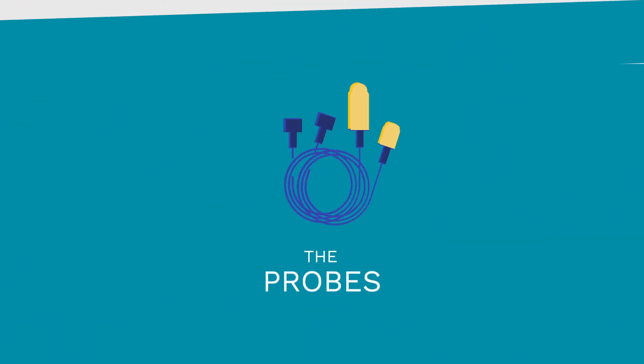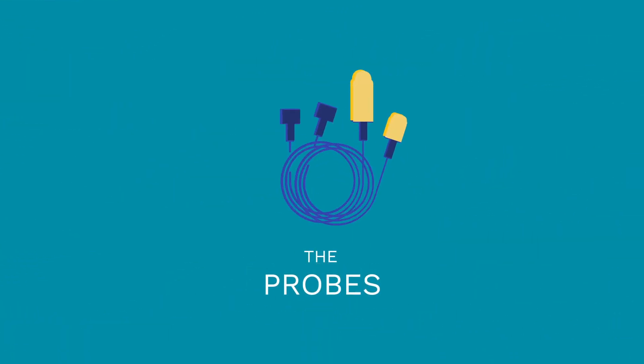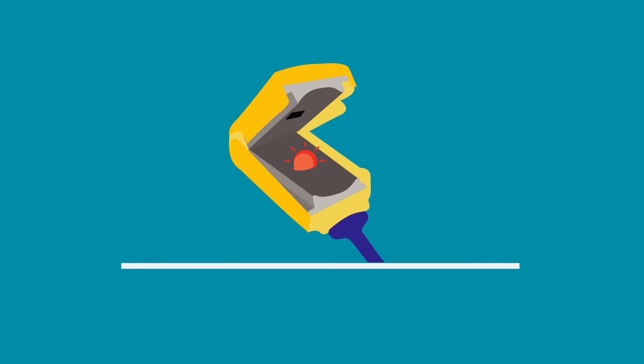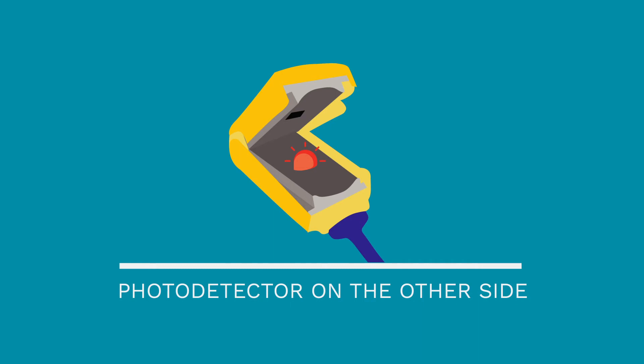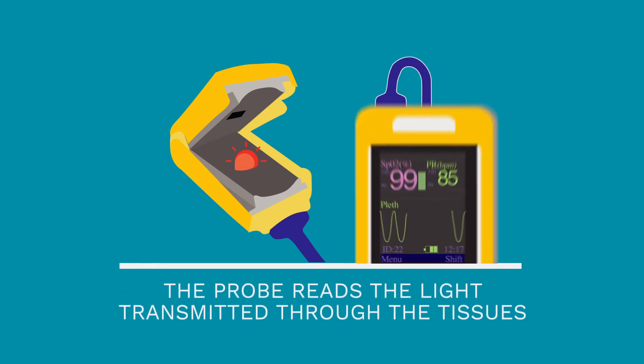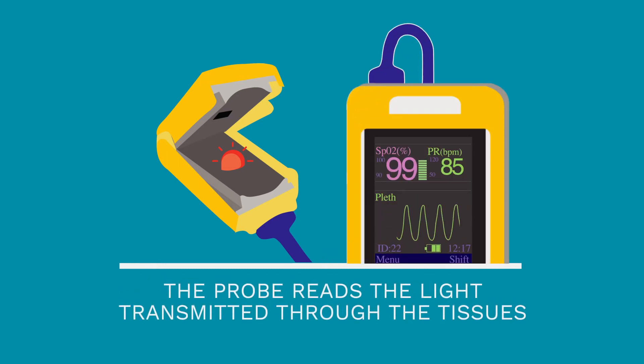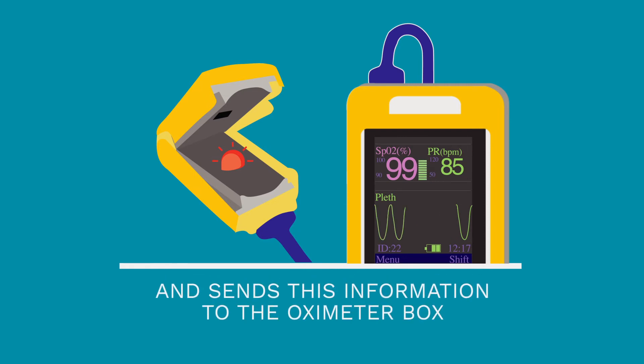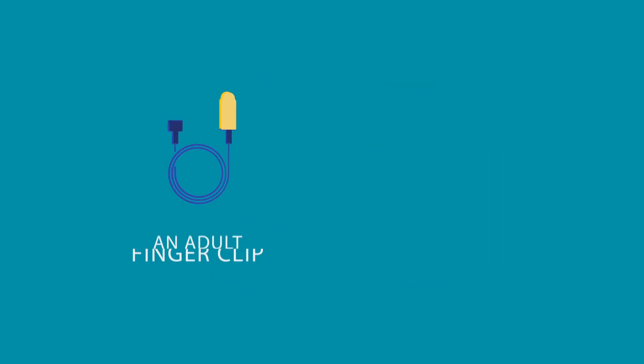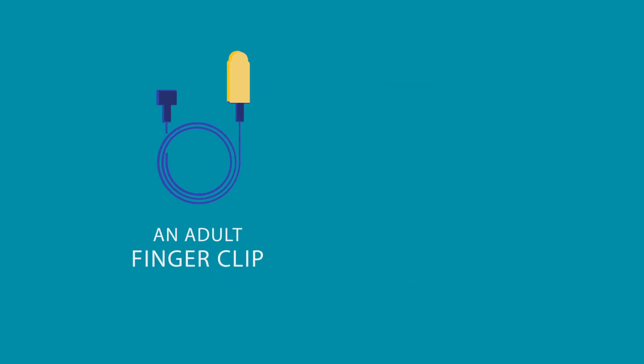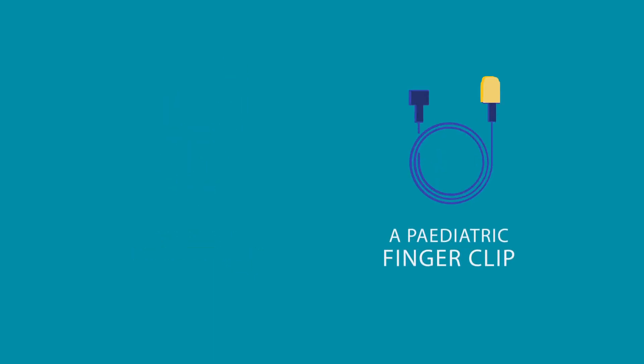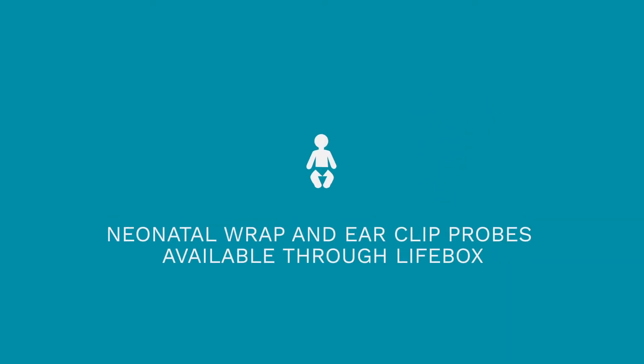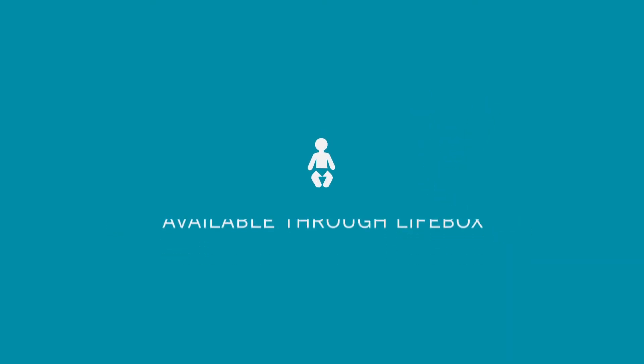Now let's talk about the probes. When the oximeter is on, you'll see a small red light on one side of the oximeter pad, the LED, and the photodetector on the other side. The probe reads the light transmitted through the tissues and sends this information to the oximeter box. The Lifebox oximeter comes with two probes, an adult finger clip which can also be used on the toe for smaller patients, and a paediatric finger clip. Neonatal wrap probes and ear clip probes are also available through Lifebox.